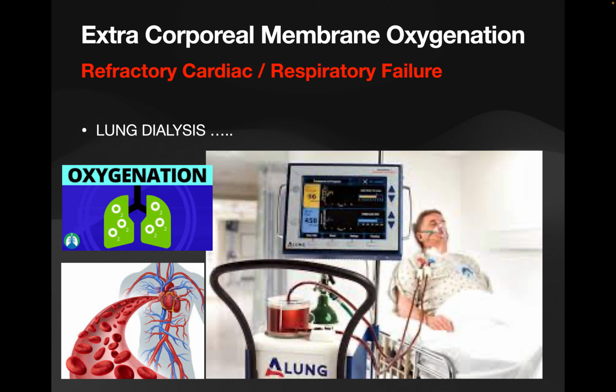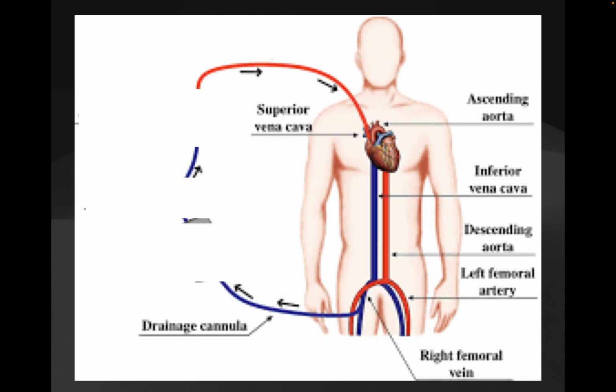And of course, in situations where you have cardiogenic shocks or poisonings or an ECPR kind of situation, we actually go for VA ECMO, and we'll come to that, to increase the cardiac output. So this is prima facie the premise of the talk, as to what ECMO does in the body.